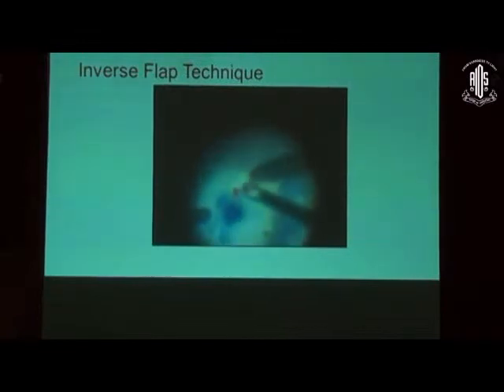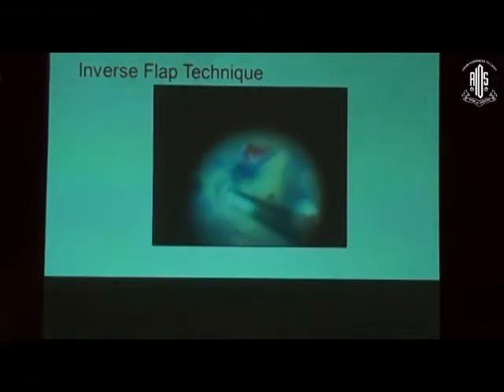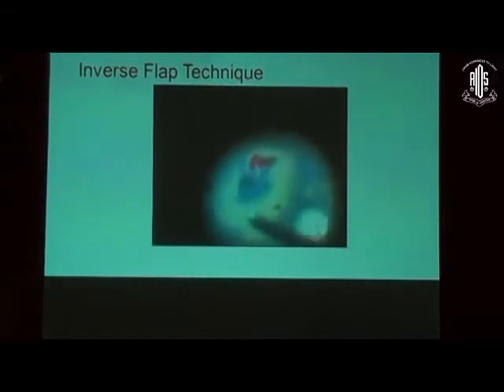The only tip during using a cutter to remove the excessive tissue is sometimes your vacuum is so fast the entire ILM can go into your cutter. So I would suggest a low vacuum and a high cut rate like this so that the excessive tissues can be trimmed all around. And these are a few pictures of inverted peel, the color fundus and the OCT pictures. This shows a bunch of tissue in the macular hole. The hole is closed. And this is a post-traumatic one. Again, the hole is closed, and we did a multifocal ERG also showing some responses.